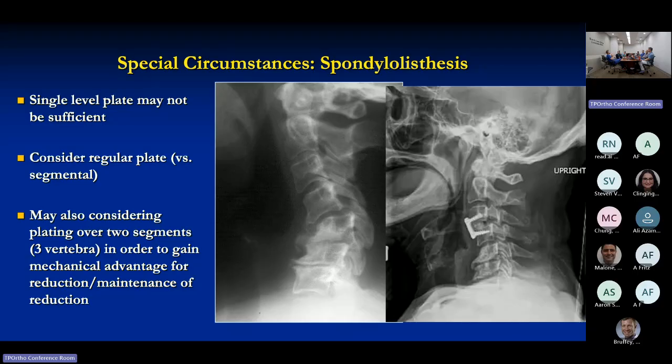The funny thing is, I'll frequently do the opposite, which is I put the 4 in the bottom and I let the plate push. It's just 2 ways to skin the cat. But I think the bottom line is you can do either way because you have flexibility above and below. Different than a fracture model, where you only have 2 bones that are broken, you're trying to reduce. So there you have other anatomic considerations.